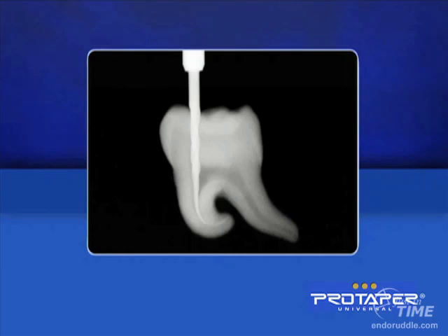I would never rotate a 2508 F2 around this kind of a curvature, but manually you can see perfectly the instrument is around the curvature and at length.